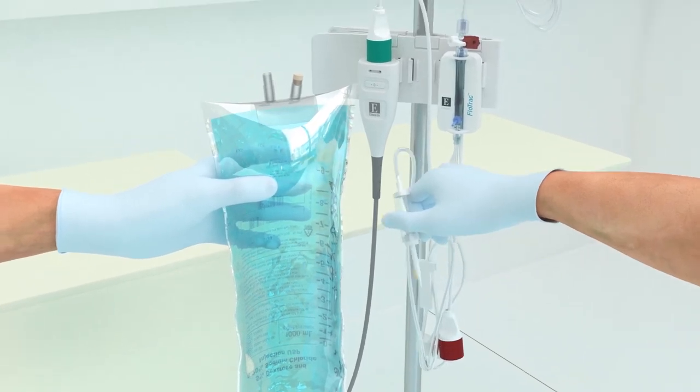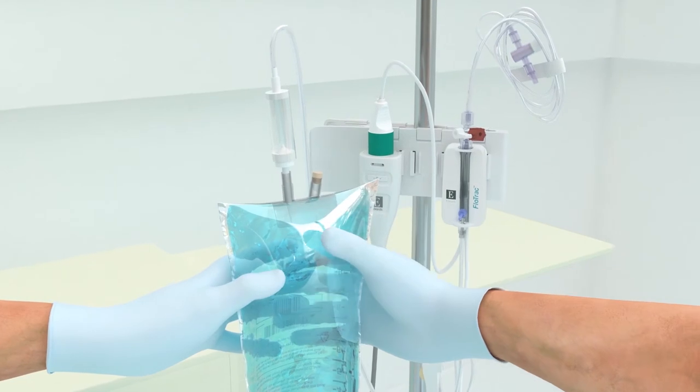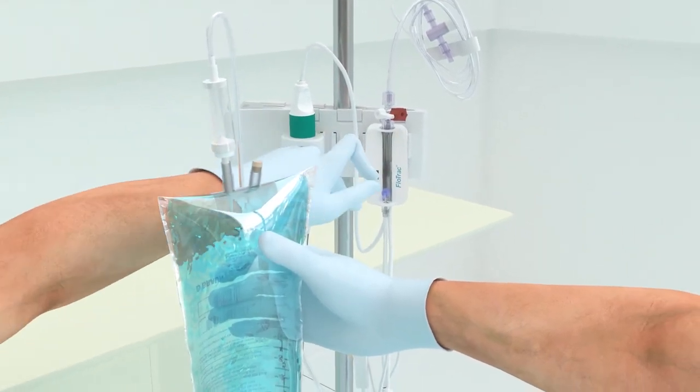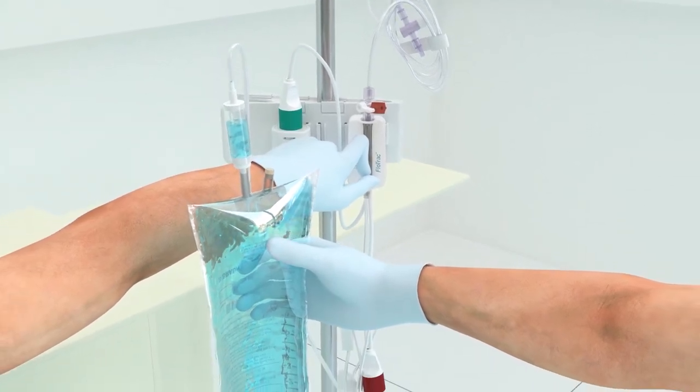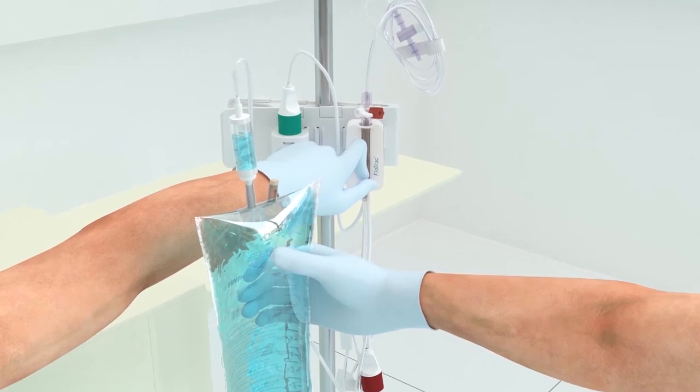Gently squeeze all the air out of the bag with one hand while pulling the flush tab with the other hand until all the air is emptied and the drip chamber is halfway filled. If air is not removed from the bag, air may be forced into the patient's vascular system when the solution is exhausted.